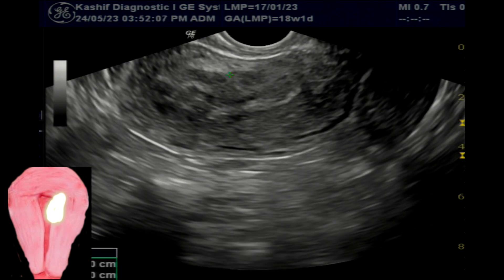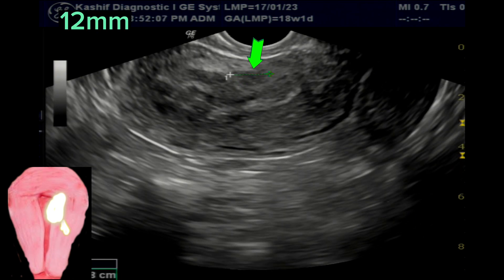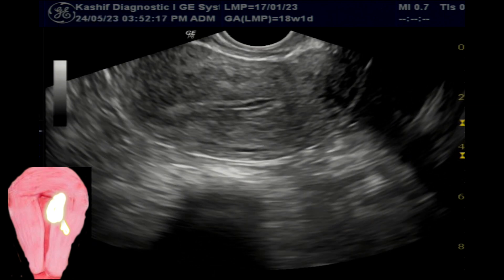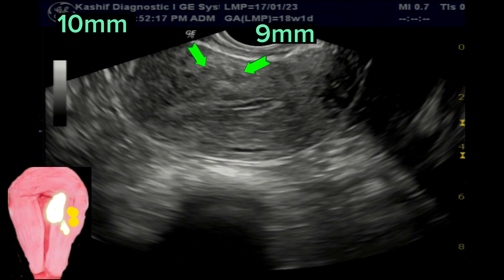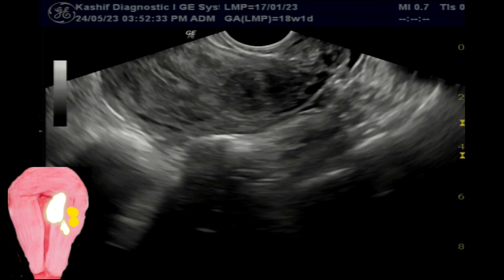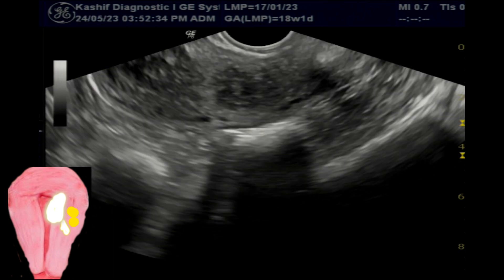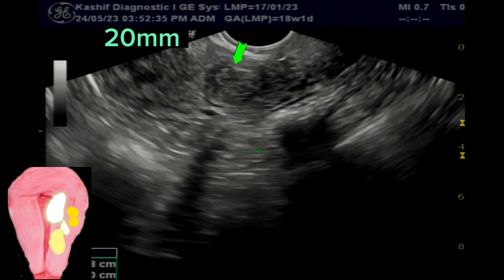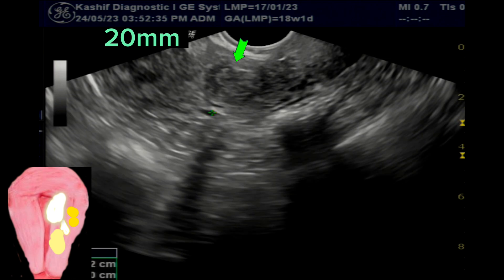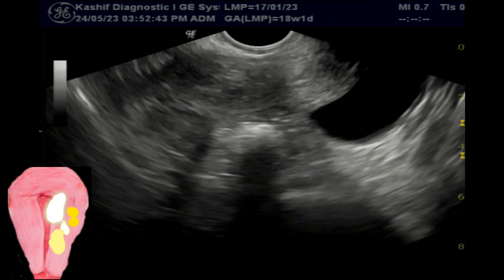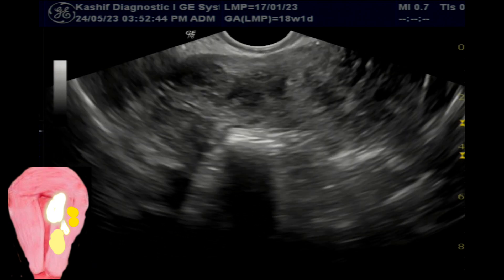There are other intramural types of multiple fibroids seen in the anterior myometrial wall. Some are small. Now this is another large fibroid seen in the mid uterine body. Posteriorly, this is also an intramural type and is pushing the endometrium mildly.